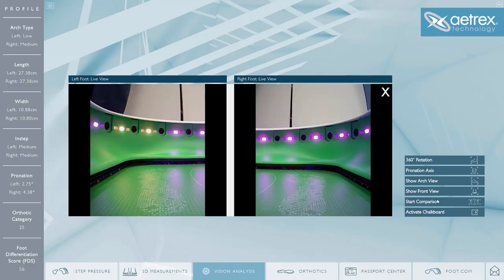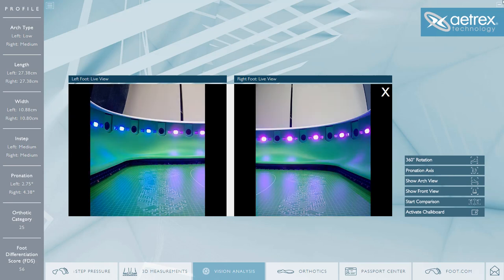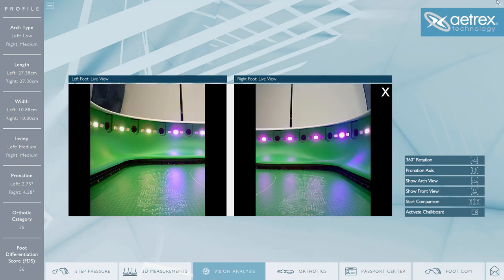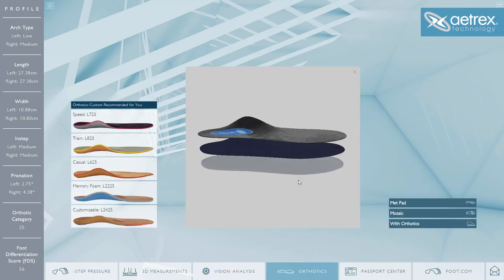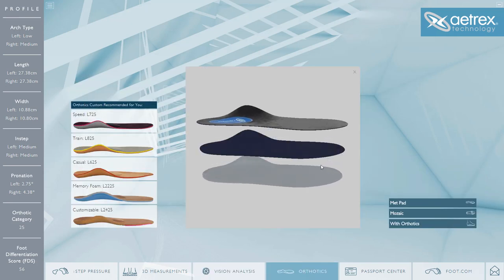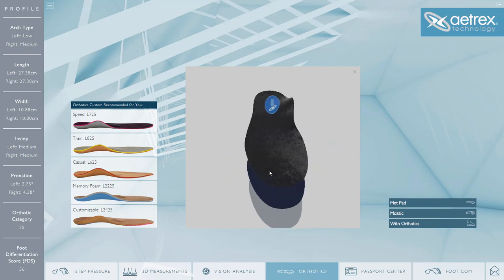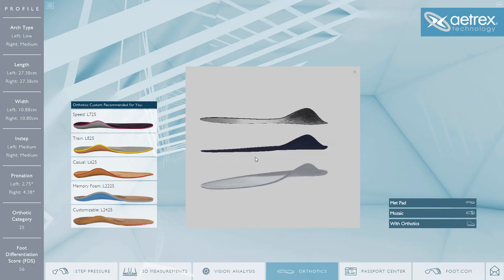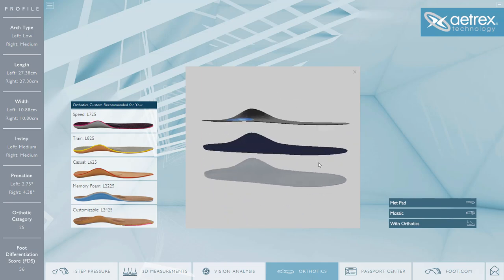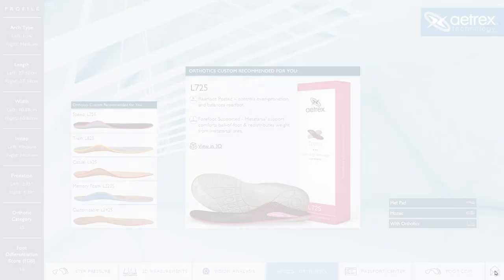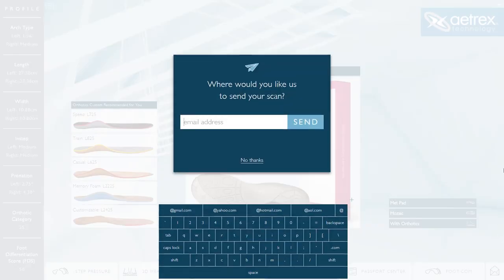We have added activated live cameras where you can see your feet live. You can view each orthotic in 3D. Your customers can continue to send emails with their measurements.